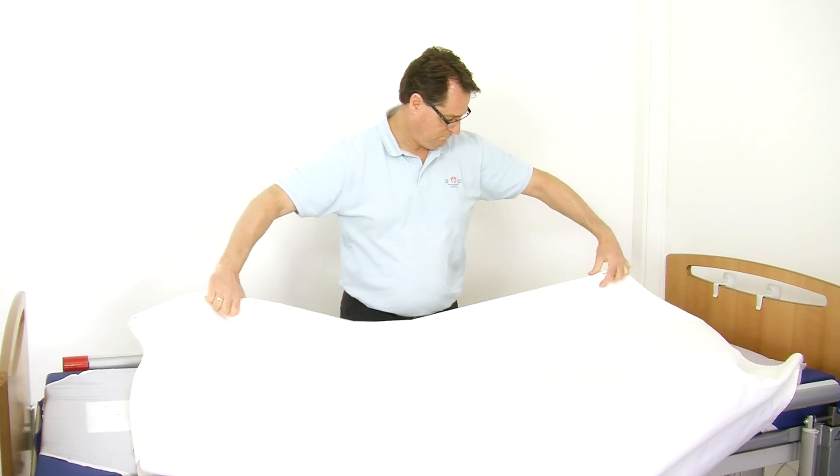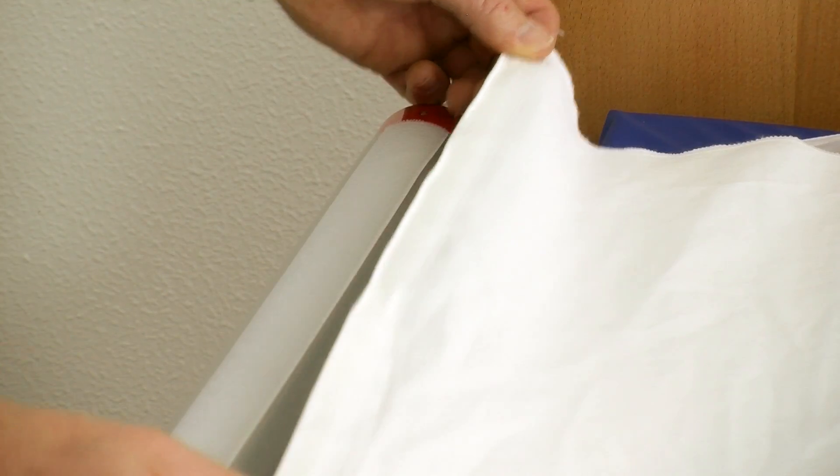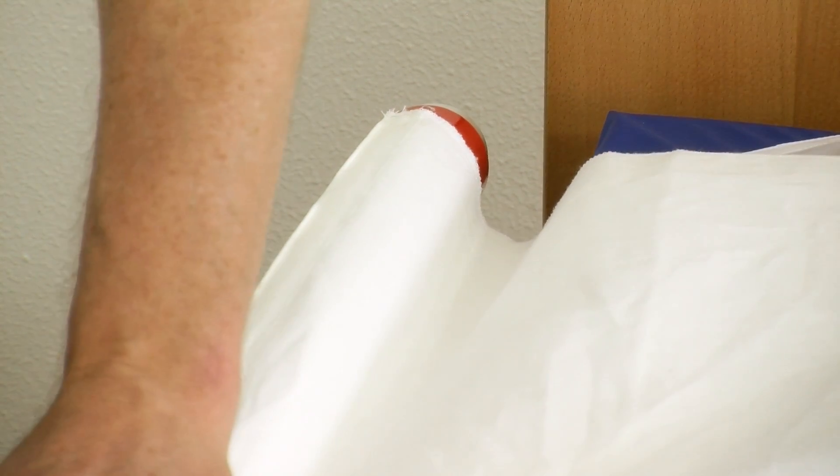Unfold the turning sheet and place it in the middle of the bed with the velcro tape down. Attach the turning sheet to the velcro tape on one of the bars.